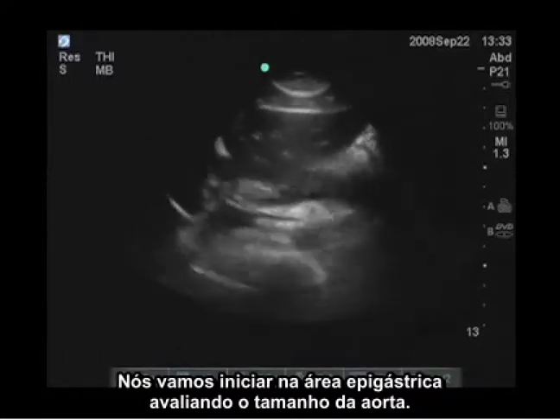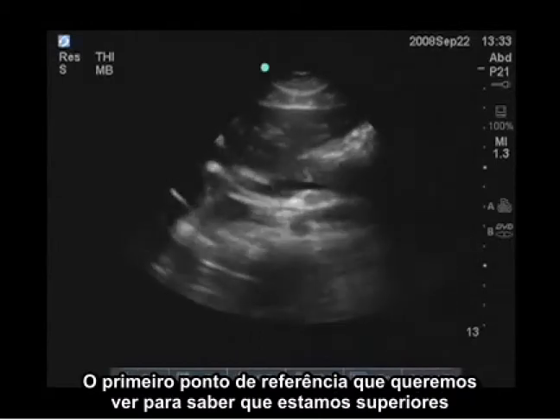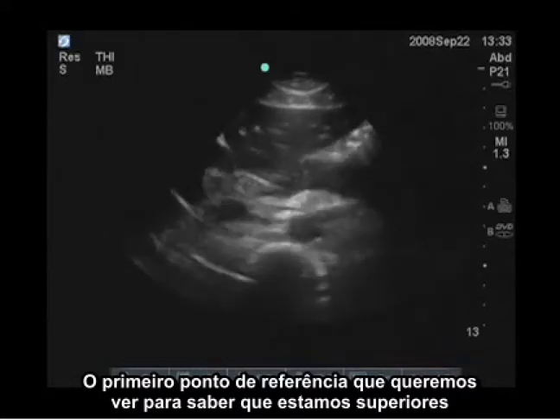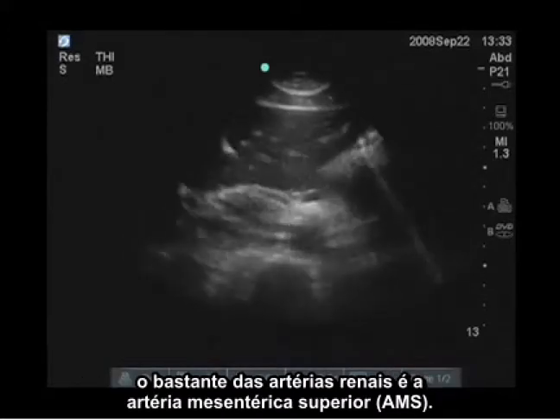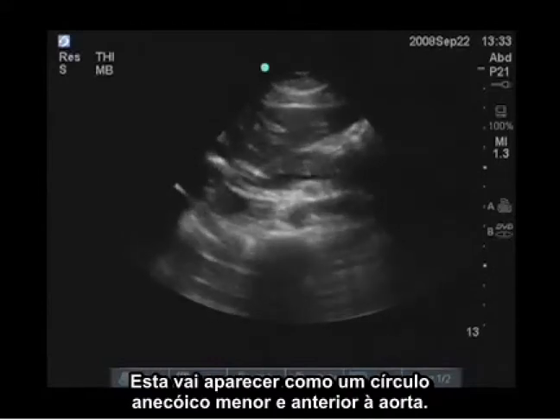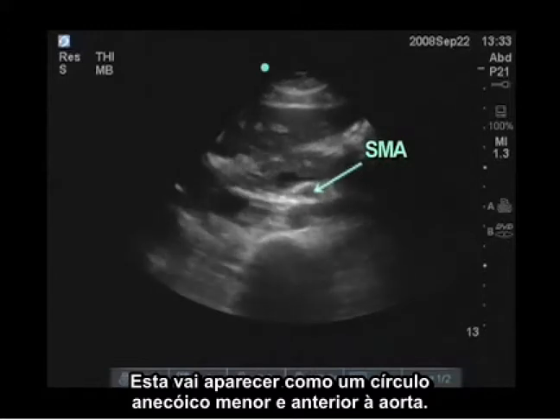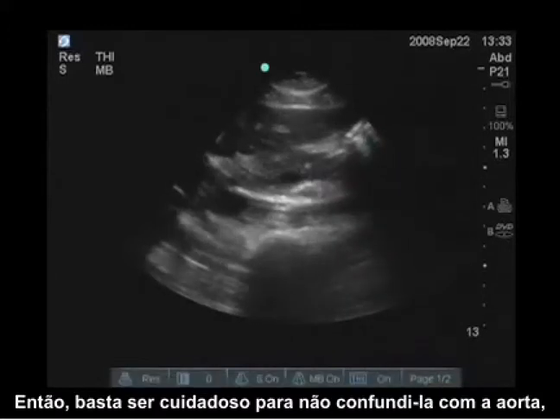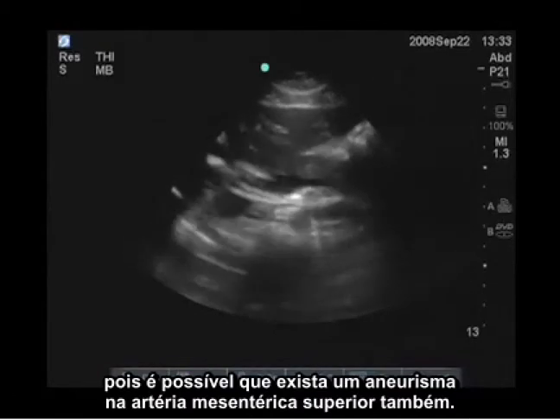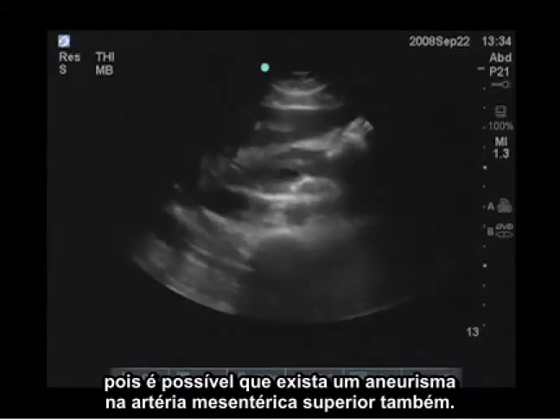So we're going to start in the epigastric area, assessing the size of the aorta. The first landmark that we want to see to know that we are superior enough above the renal arteries is the SMA. This is going to appear as a smaller anechoic circle just anterior to the aorta. So just be careful you don't mistake this for the aorta, because it is possible there could be an aneurysm in the superior mesenteric artery as well.